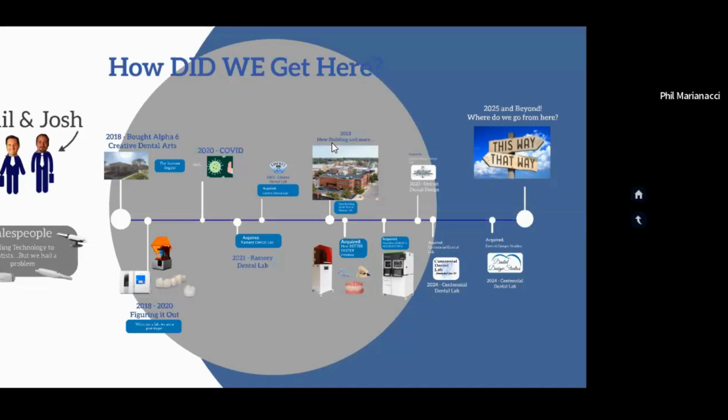And so I'm really happy that we did. We've learned a tremendous amount. But the first two years we were doing research and development, and we were buying the equipment that we could afford, and we started looking to see how we can make things easier. And we were talking about workflows that were streamlined and kind of an all-encompassing software, which doesn't exactly exist in everything that we do, but how do we narrow things down? Because we were really technology people too.